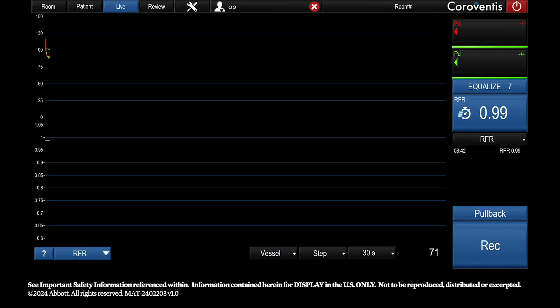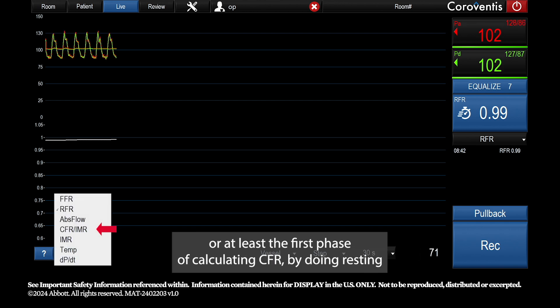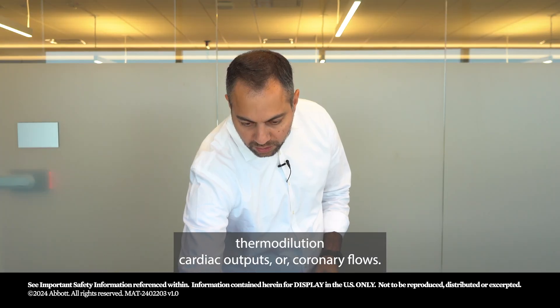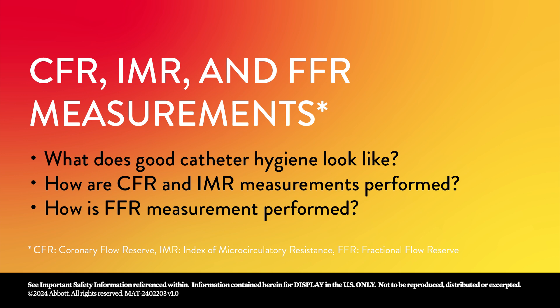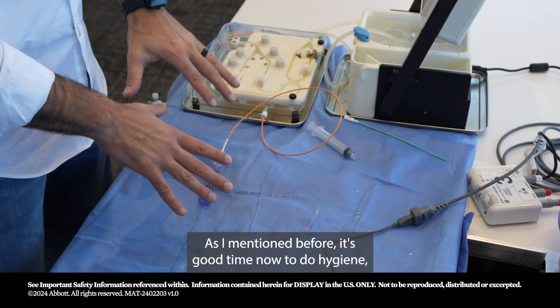There is no significant epicardial disease or stenosis in the LAD. It's now time to perform CFR and IMR measurements, or at least the first phase of calculating CFR by doing resting thermodilution cardiac outputs — coronary flows. I've switched to CFR/IMR mode and now I'm ready.